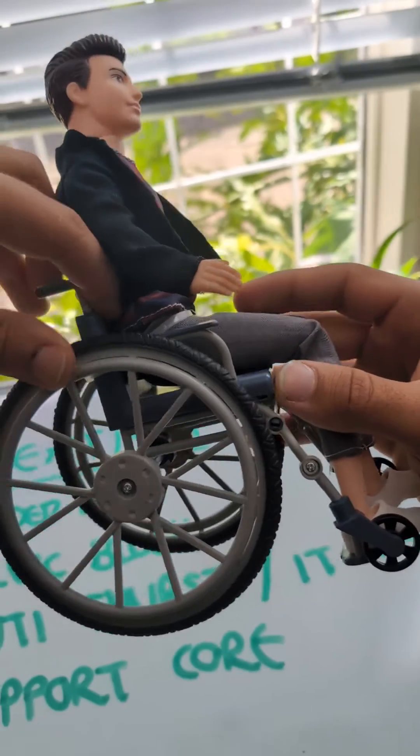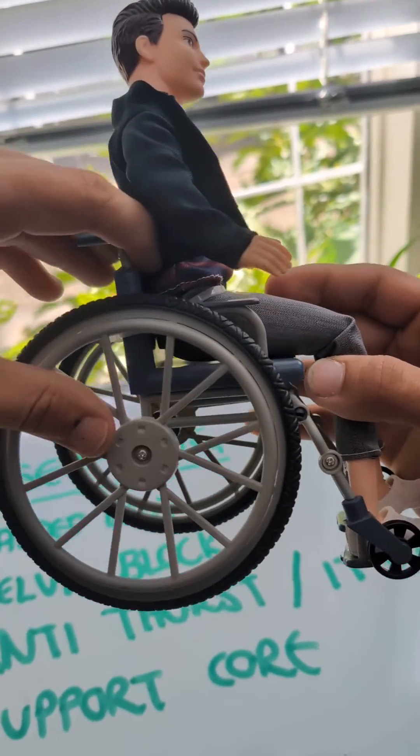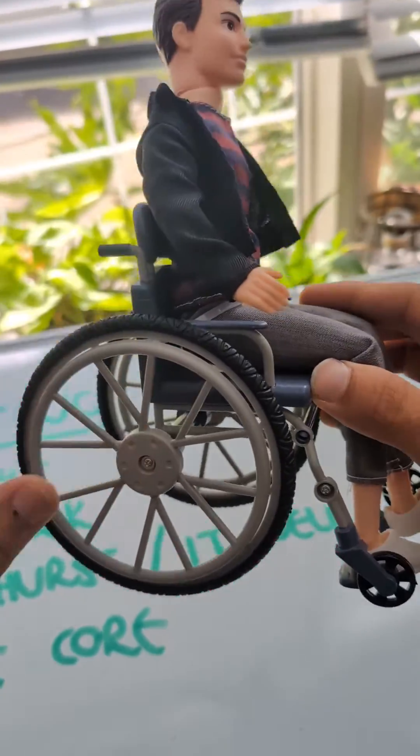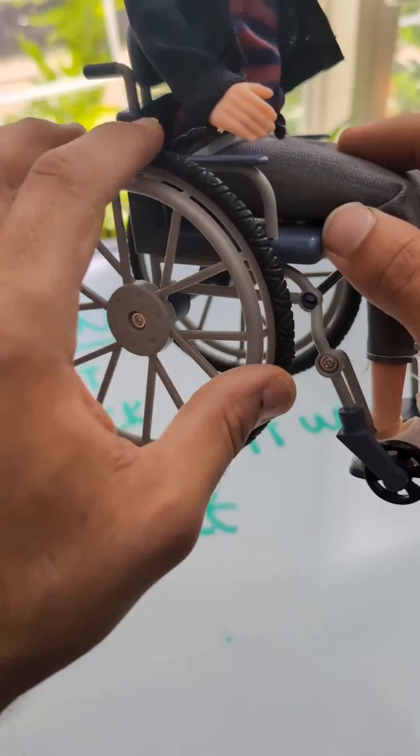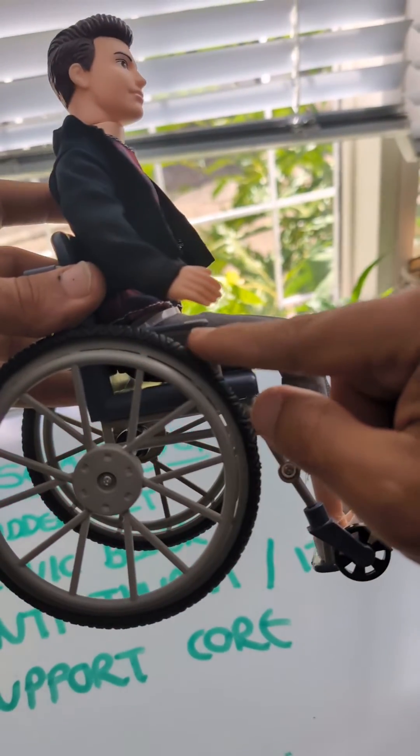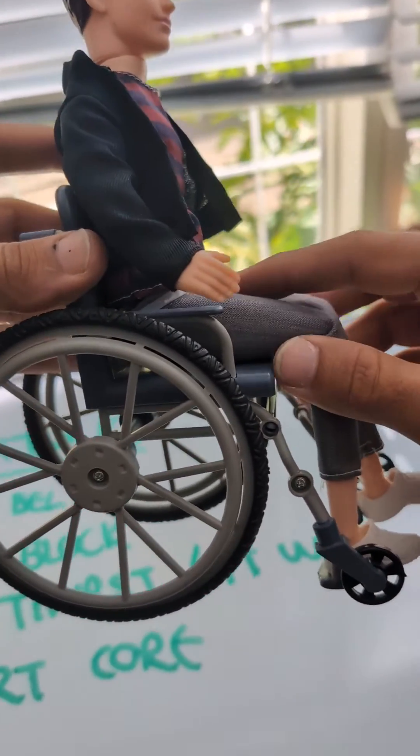You want to support the pelvis by pushing a little bit of extra padding over here, just at the PSIS to tilt that pelvis forward. You want to use an anti-thrust style of cushion or some sort of IT well, ischial tuberosity well, to sort of sink the bottom into the cushion and create a bit of a ramp under here to stop the client from sliding forward.